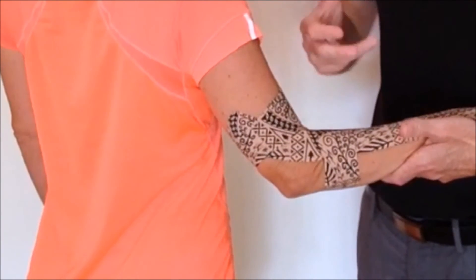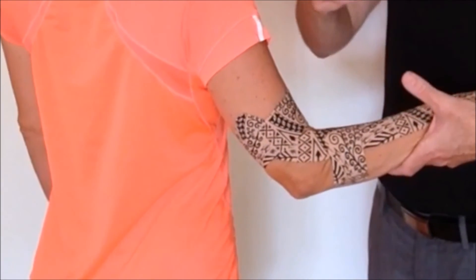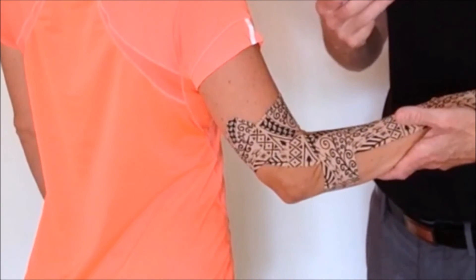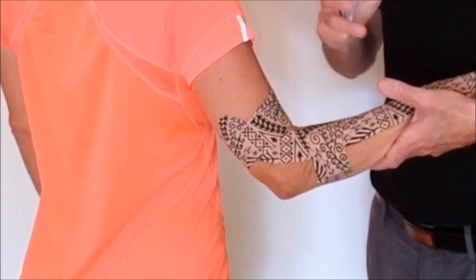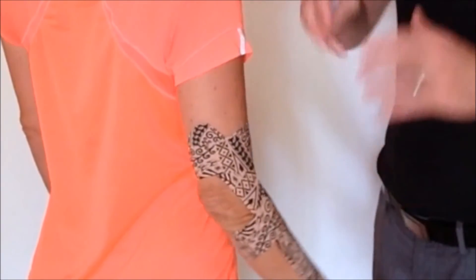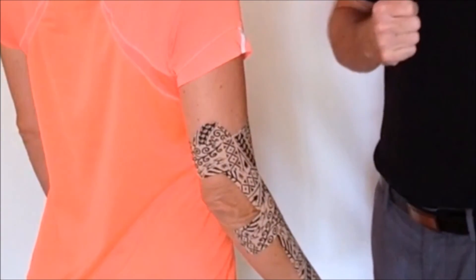Muscle tears are obviously a big one. We know that by boxing up — the work by Gerdahl in 2014 showed boxing up in the quadriceps muscle reduces the mechanical stress on those tissues even under contraction, except for when it was in its absolute shortest position. So for muscle tears, we can come in and box up to reduce that strain and mechanical stress on those muscle fibres themselves. It's not lifting skin to create space; it's actually pulling everything together and holding it there using that strong recoil of the tape.